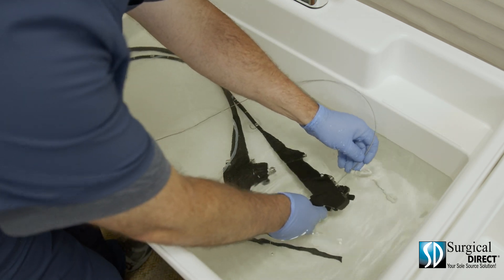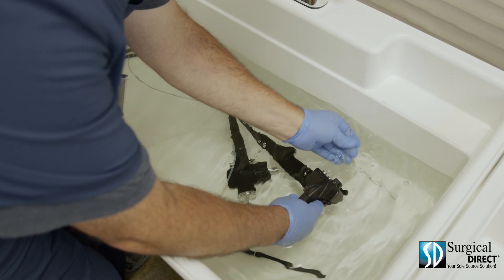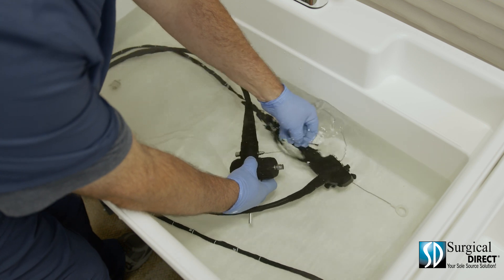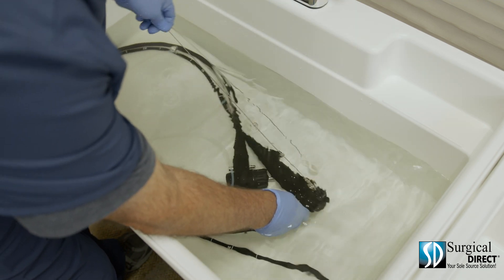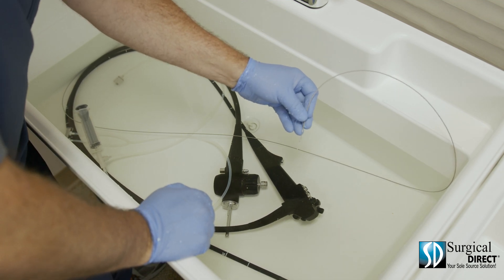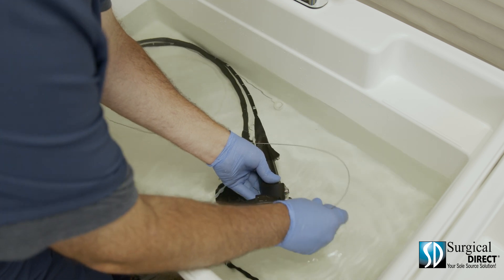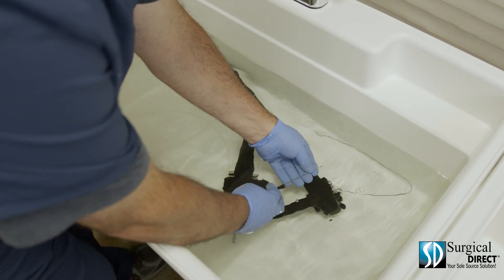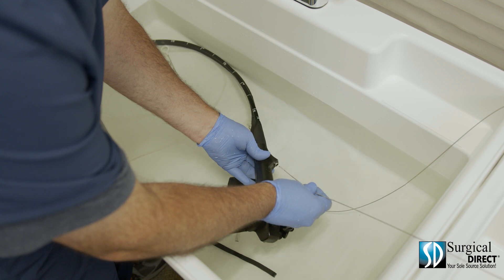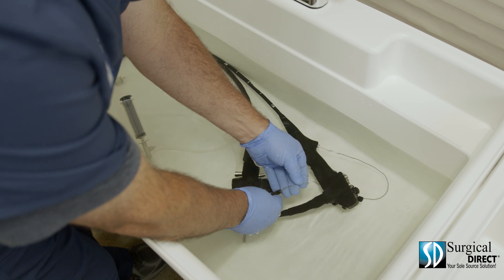Using a soft sponge, thoroughly clean all external surfaces of the scope. At this point, you can disconnect the automatic cleaning channel. Using the supplied cleaning brush, brush each lumen of the scope. Start with the suction and push the brush straight back through the scope. Advance the cleaning brush until it exits through the suction port — be sure that the bristles are clean. Completely remove the brush. Brush this channel of the scope until the brush comes clean three times. Next, at a 45-degree angle, advance the brush down the suction channel of the insertion tube. Be sure the bristles are clean and repeat this step for a total of three times. Lastly, insert the cleaning brush in the biopsy channel and be sure that it comes out clean. Repeat this step three times as well.